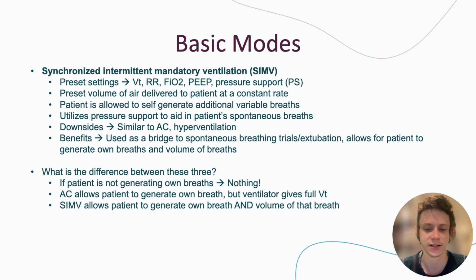However, unlike assist control, which is patient-triggered, ventilator-controlled breathing, spontaneous breathing is patient-triggered, patient-controlled breathing, which means the patient is going to determine the tidal volume that they get on their spontaneous breath. So they're not going to be administered the full tidal volume. The SIMV utilizes the pressure support to aid in the patient's spontaneous breaths.